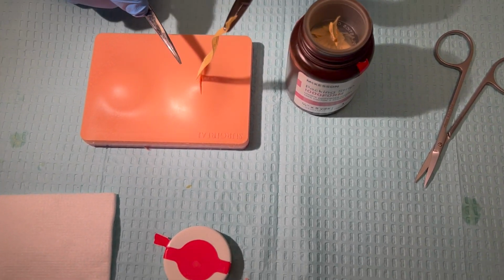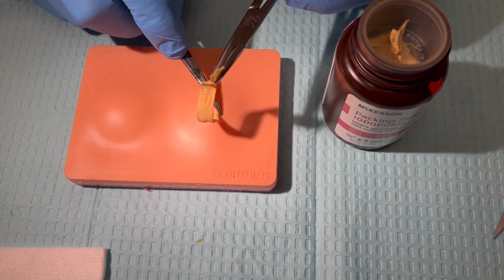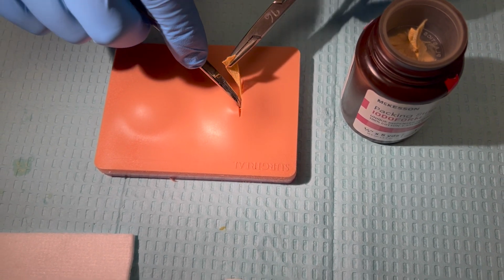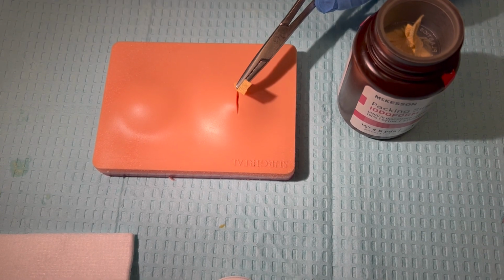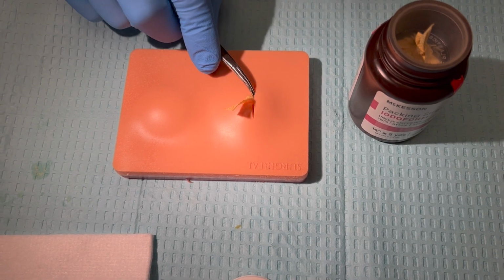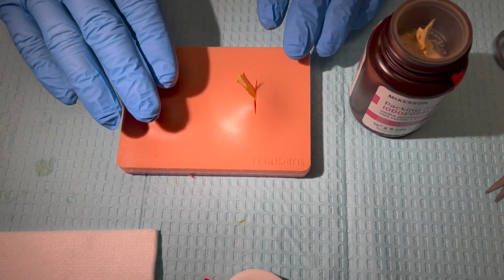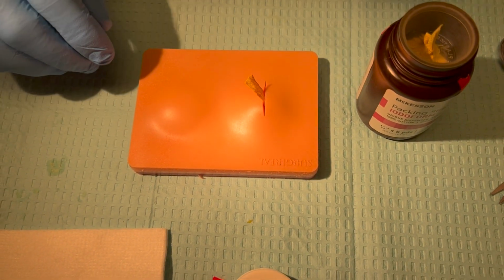We're going to insert this. We could use our curved hemostats, or we could use the opposite end of a cotton-tipped applicator, and we're just going to fill that region enough that this will not come off. We'll release our grip on that packing. Release. We're going to leave, again, approximately 1 centimeter hanging out. This will prevent the wound from closing, and it serves as a wick for continued drainage.